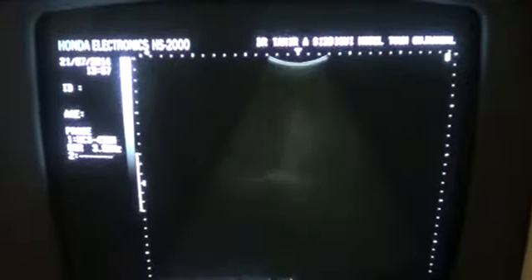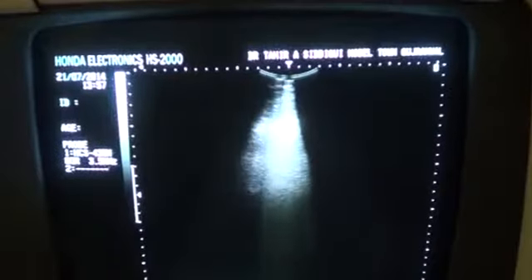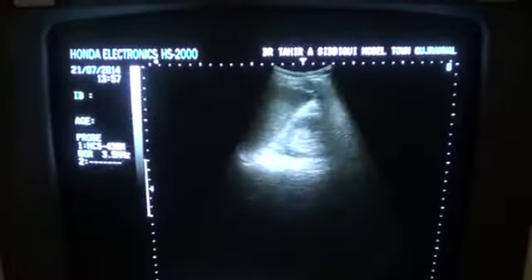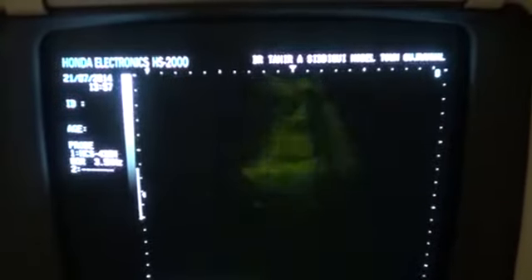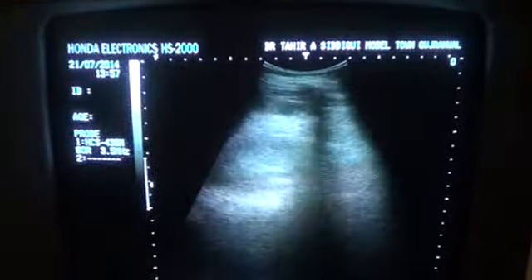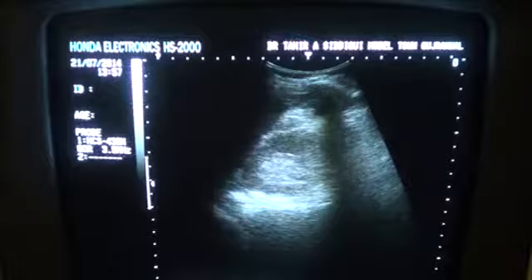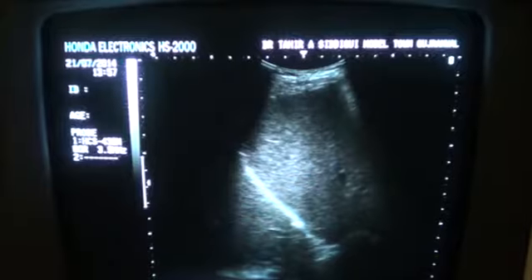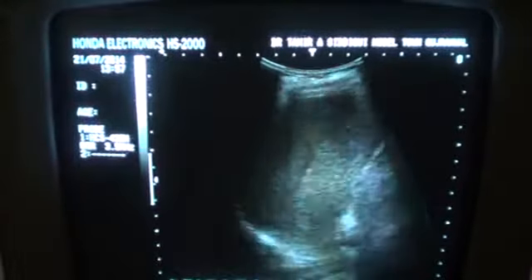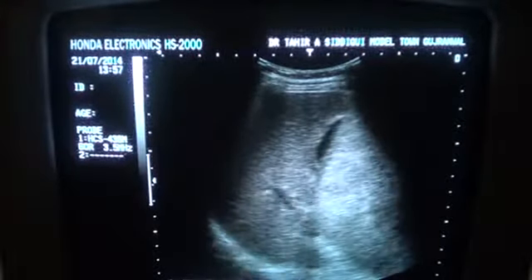Kidney. I'm asking the patient to turn to the left decubitus posture to get a full view of the kidney to see what its relation is. Now, does it relate to the kidney? No. This is the upper pole of the right kidney, and this is the lower pole of the right kidney. Both poles are clear. Kidney is normal, and the liver is showing only fatty changes. Nothing more than fatty changes can be seen.